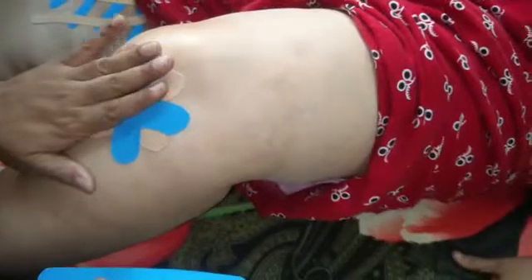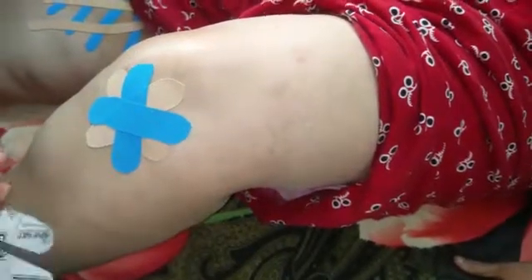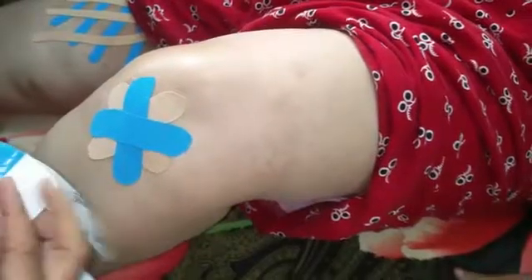Tape has already been applied here. We can tape on the area which is already taped — that's not an issue because we are just doing this for maintenance of stability. I can tape on the region which is already taped; this is fine.